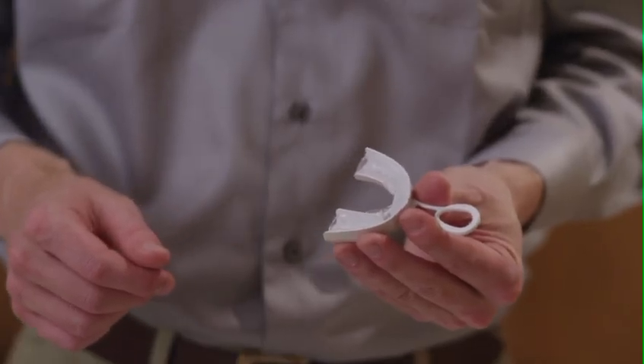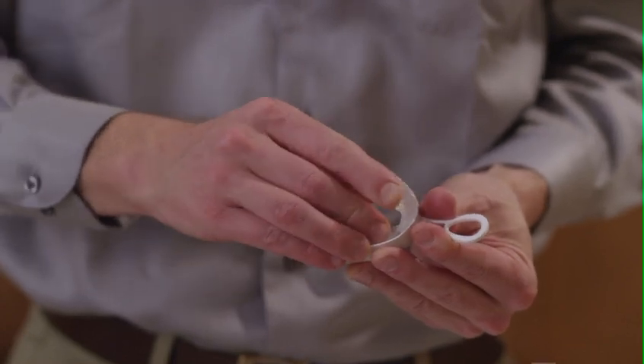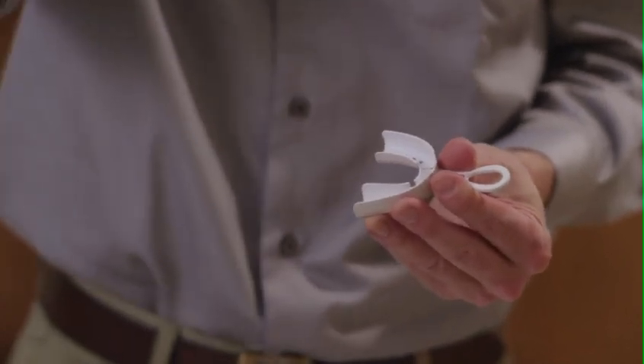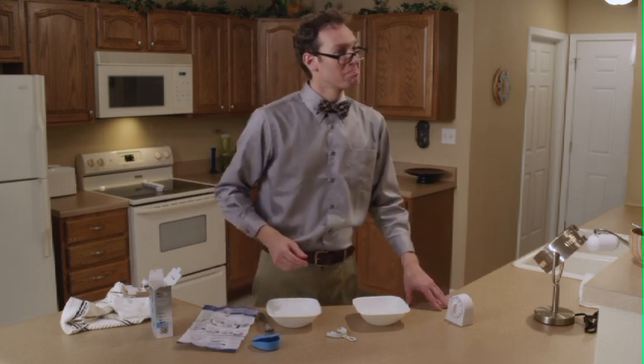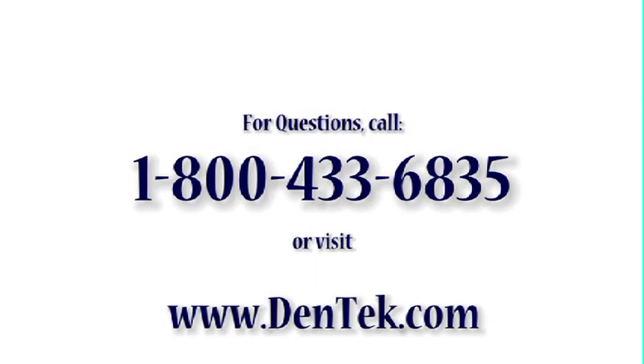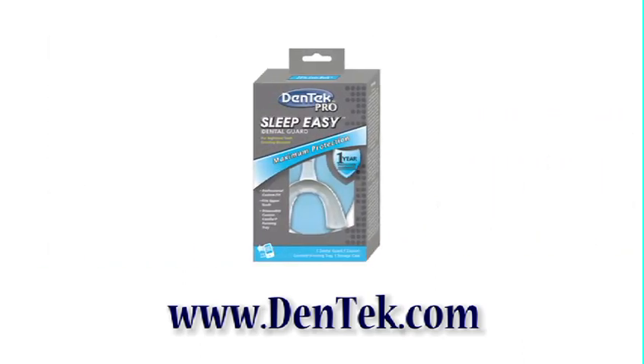Once cool, remove the Dental Guard from the custom comfort forming tray. Gently pull the ends from each side of the tray, then work around to the front. It is normal for the Dental Guard to slightly stick in the tray. Your Dental Guard is now ready for use. It should fit comfortably; however, if you did not get a good fit the first time, repeat the boiling process beginning with Step 1 of the final fitting instructions. If you have any questions, call 1-800-433-6835 or visit www.dentec.com. Sleep easy with Dentec Oral Care.